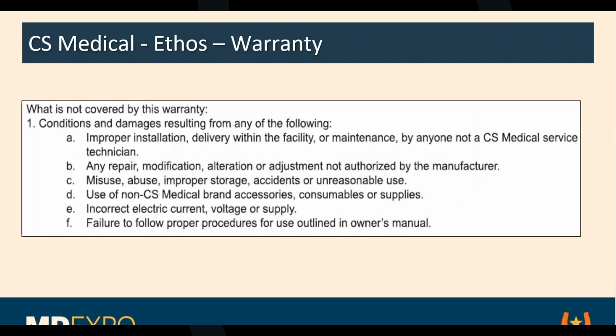So it'll tell you what is covered and what's not covered by the warranty. Make sure you read those things so that you can keep it. Those are the guardrails for keeping your probe safe from the user and getting the full length of time that the useful life of a probe is intended for. How many know what the useful life of a probe is intended for by the OEMs?